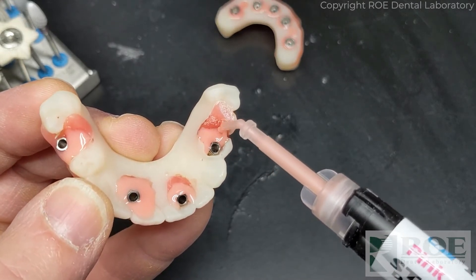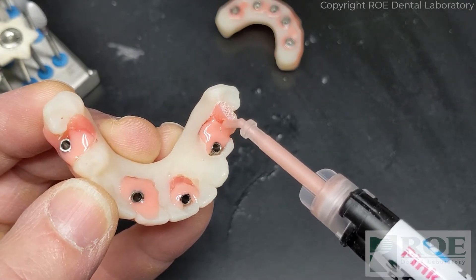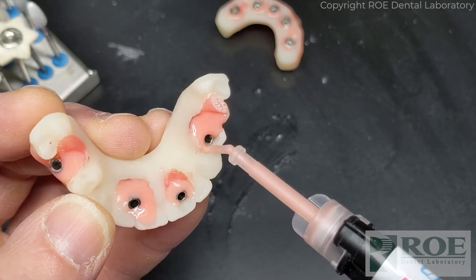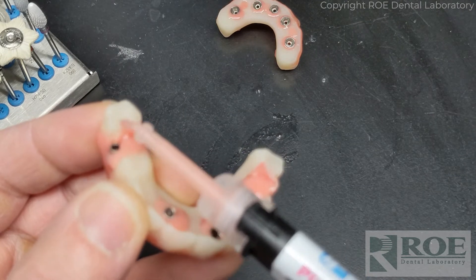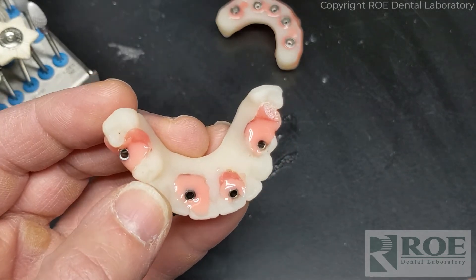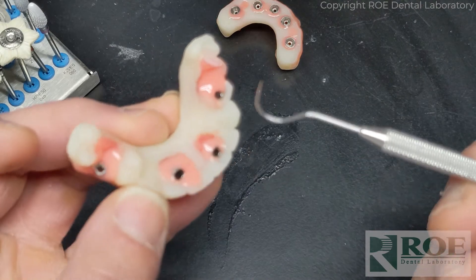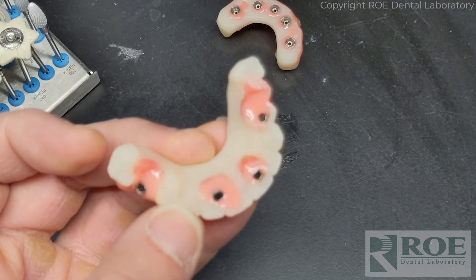There was a little bit of an issue with the guided mount for the implant - the doctor just did not have the right tool on hand, so that's why these implants are in a slightly different area than anticipated. That's really completed right there. We'll come back and adjust the metal - you can see there's a little bit of metal exposed here - and probably reduce some of this lingual. We'll see what it looks like when we articulate, so I'm going to hit it with a light.